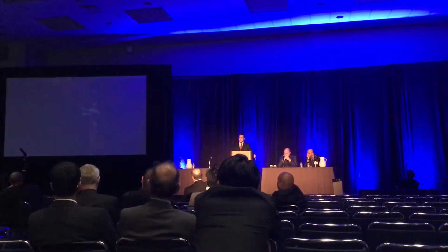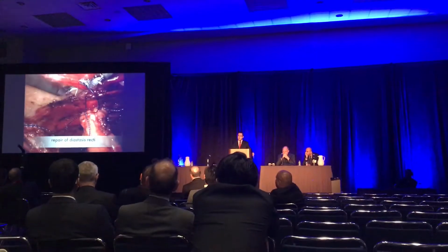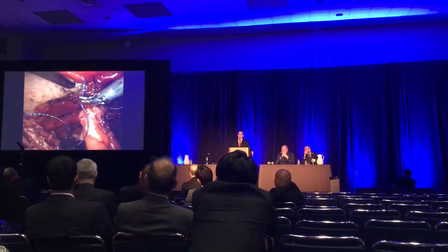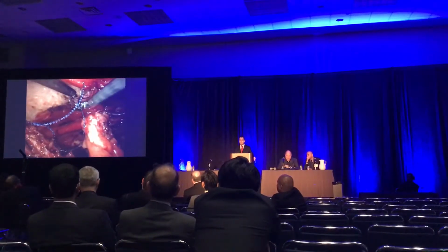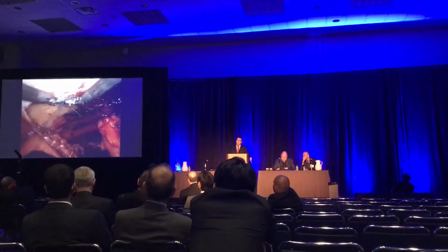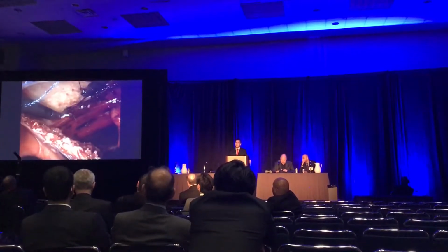This shows the completely closed defect. The midline defect is then closed in a similar fashion. We are advocates for closing the defect. We believe that creates a sturdier repair and allows for a better abdominal function.